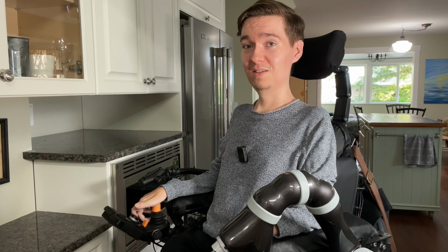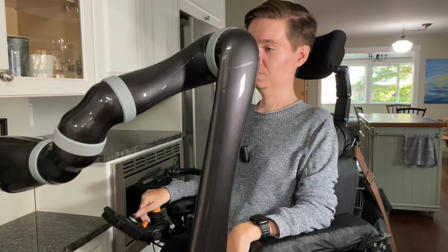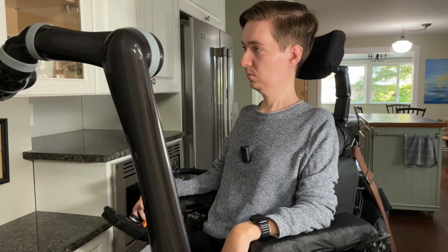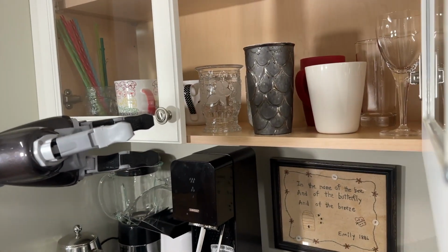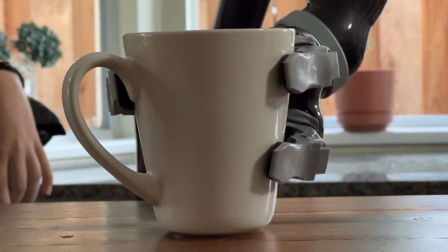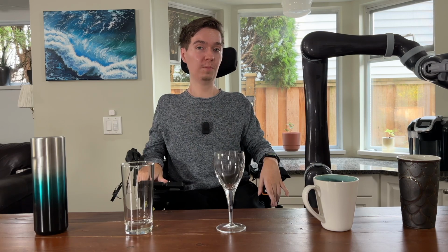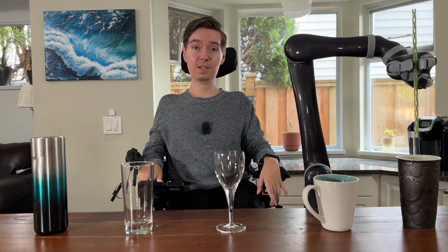The first thing we need is a cup. I've laid out 5 different cups here in a variety of shapes, sizes, and styles to demonstrate that your cups at home will work no matter what they look like. Using Jaco with a straw is also entirely possible and is my personal preference, but the option is up to you, of course.